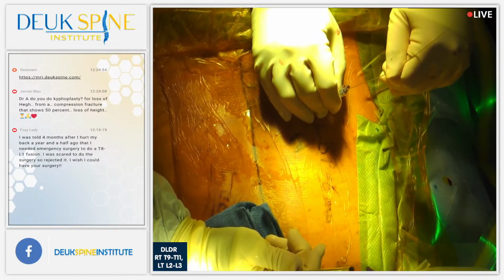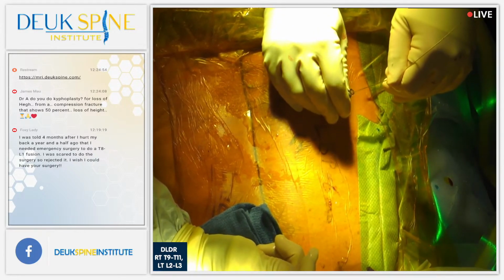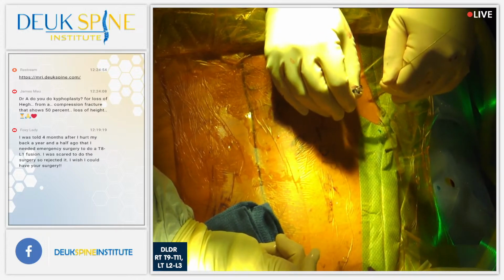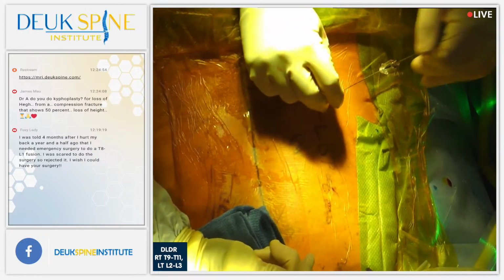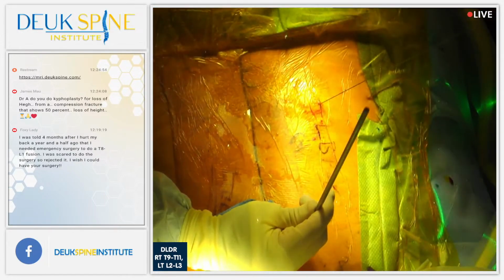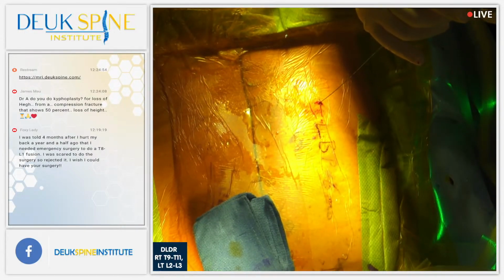Now the good news is, see this disc right here? It has a small tear, if anything. But it's definitely painful. So I think that this disc will be a pretty quick one to fix. I'm hoping. I probably just jinxed myself, but I'm thinking 10 minutes and we'll be done, Dr. Berndes.